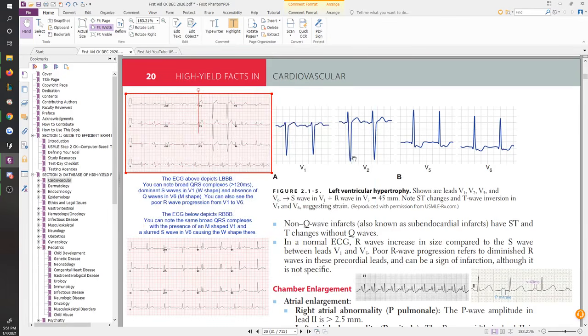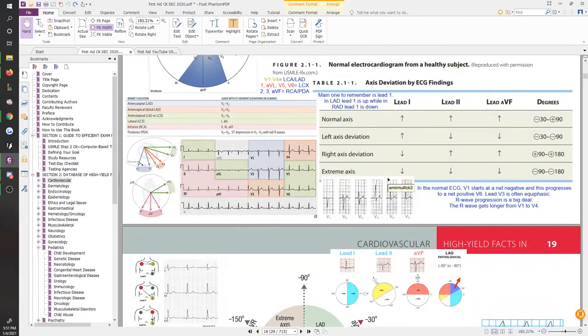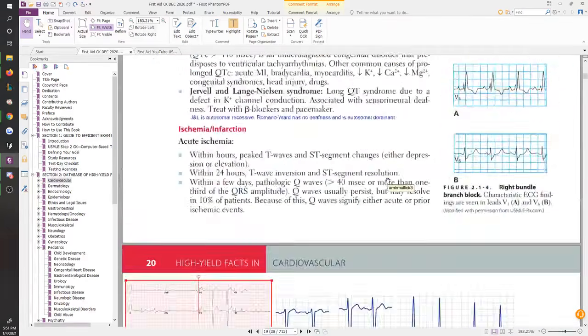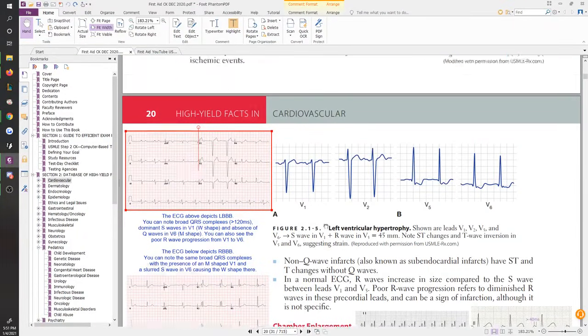But we just saw, when we looked at the normal QRS, that V1 was supposed to be the lead that was very tiny, not any other. So there's a chance there might be axis deviation in there. But the other thing is just noticing that V1 through V3 are strong.